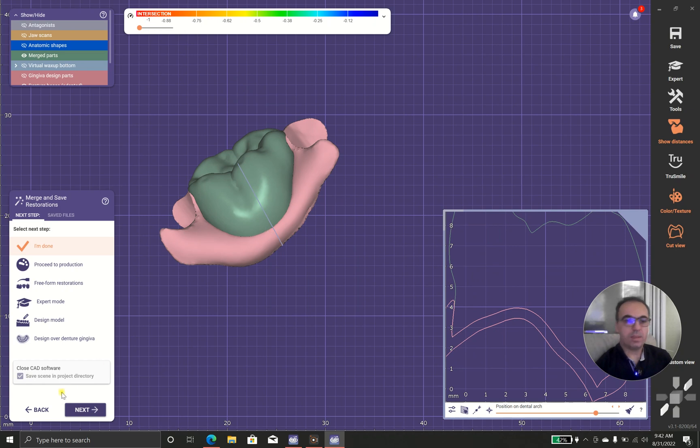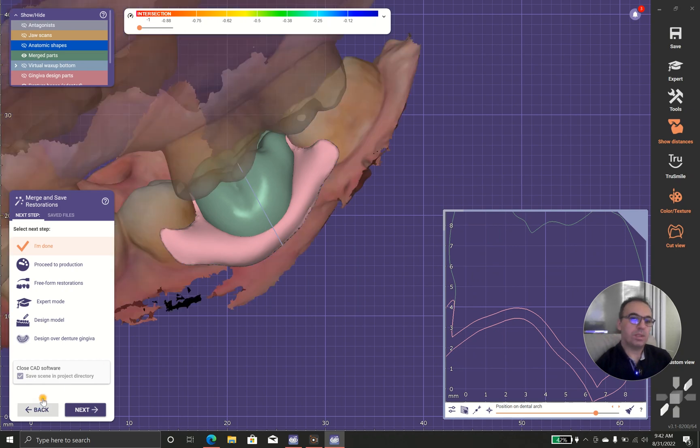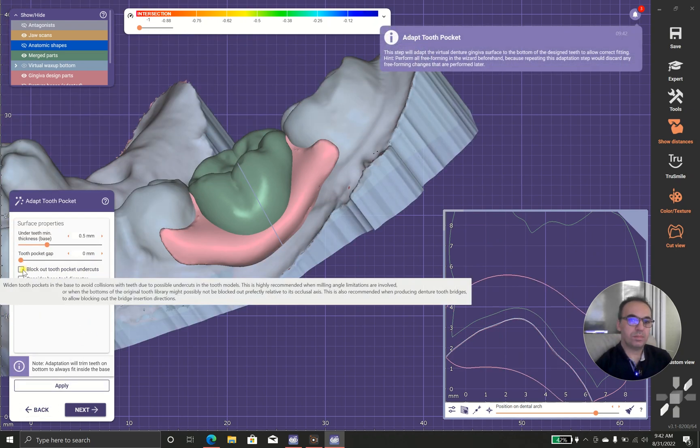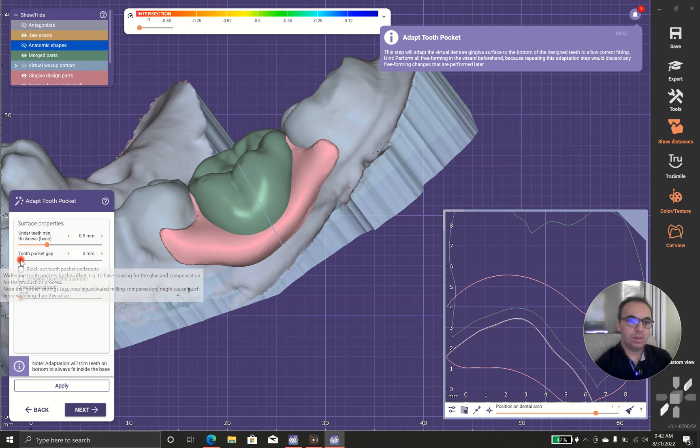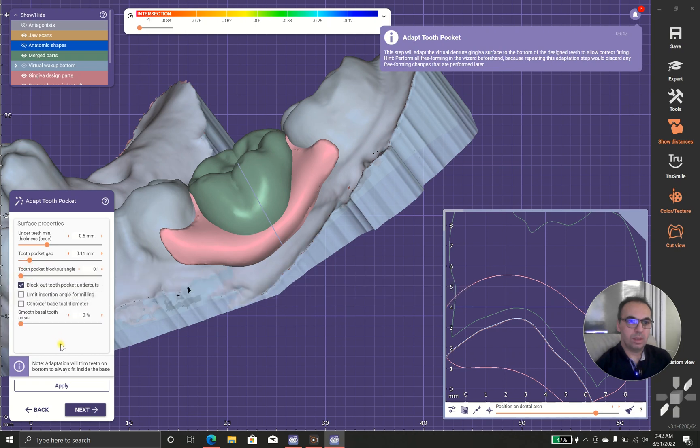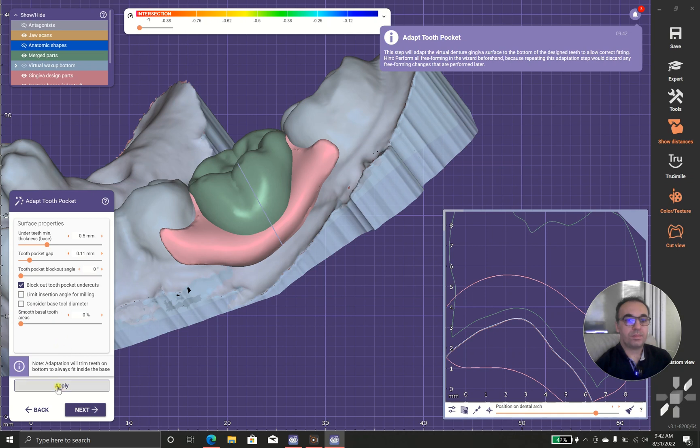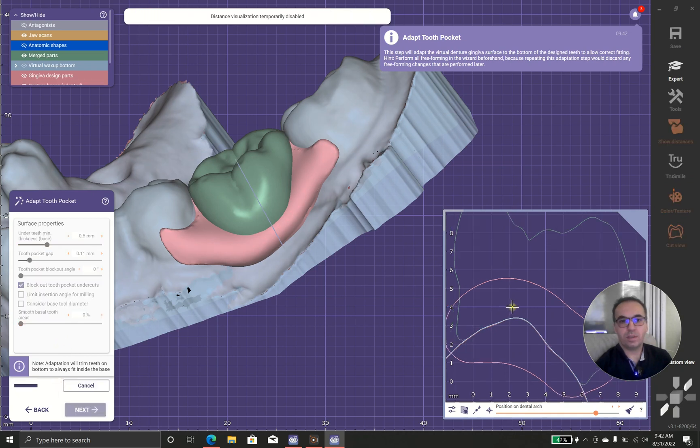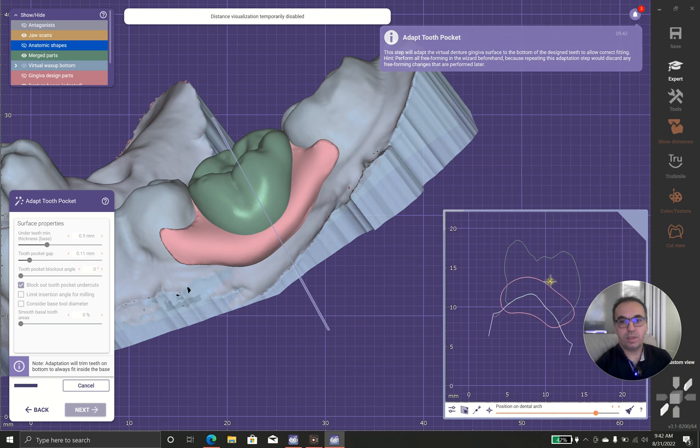But in case I want to have this separately printed, I can do this.